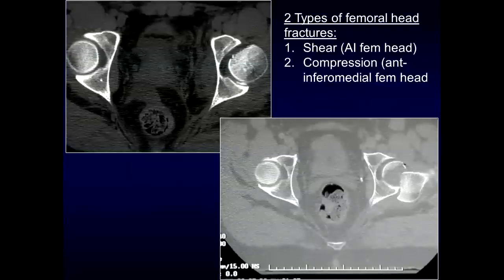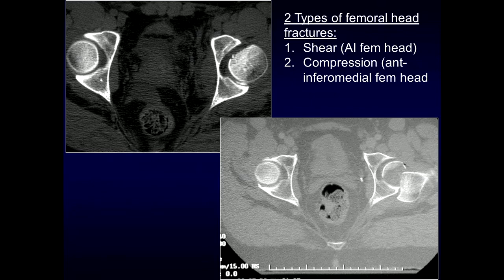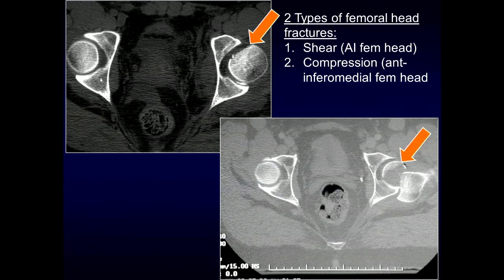There are two types of femoral head fractures. You can have a shear type fracture — most commonly it's the anterior inferior aspect of the femoral head that gets sheared off following dislocation. Or you can have a compression type injury, most frequently at the anterior inferior aspect of the femoral head, similar to a Hill-Sachs impaction fracture that you get in the shoulder. Here we see fracture of the femoral head with the fragment displaced into the acetabulum and an associated intraarticular fragment.